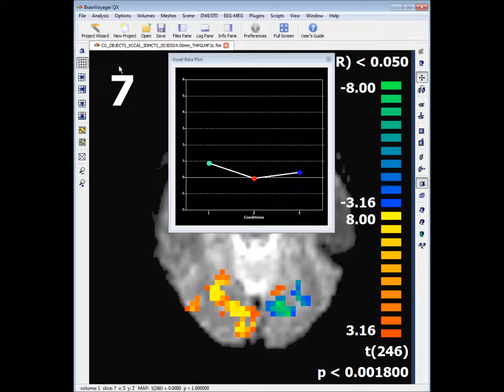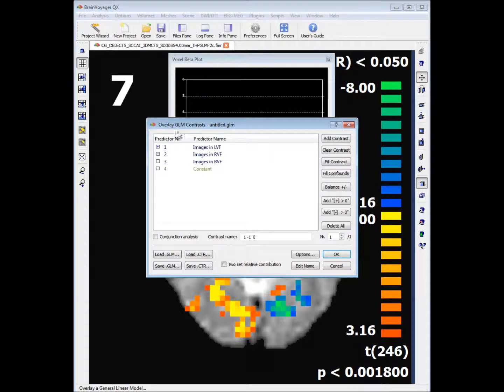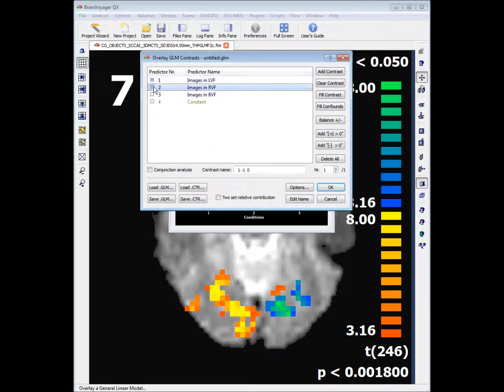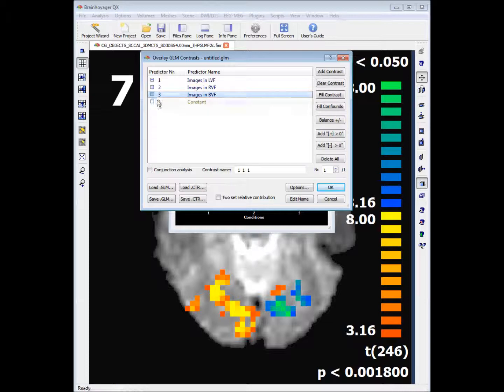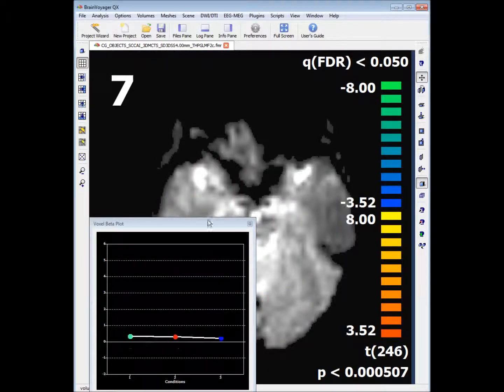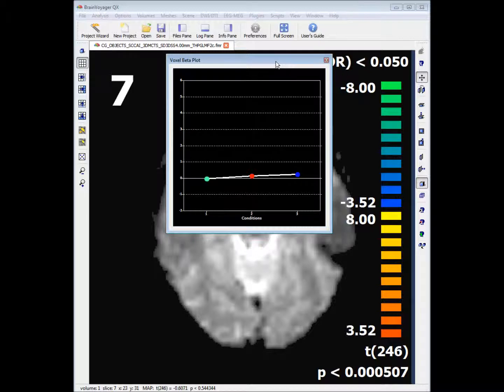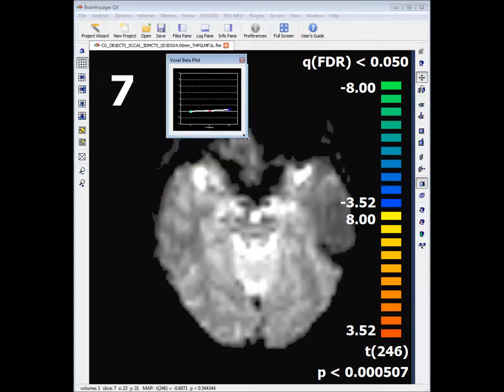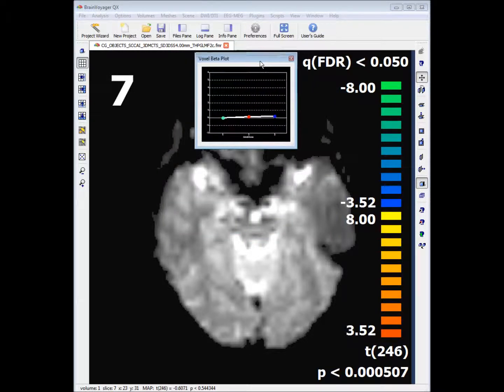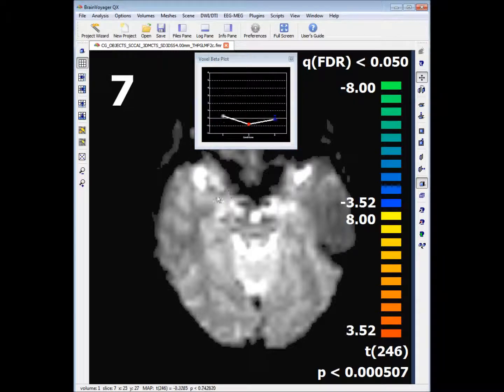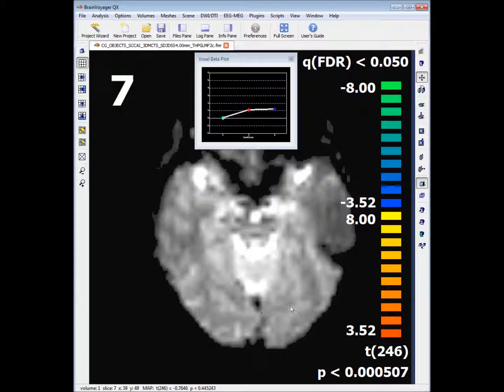If we were to have a plus sign for both Images in LVF and RVF, and a minus sign for Images in BVF, what we're seeing are regions where the activation for the first two predictors differs significantly from regions that are active for both visual fields. And intuitively that shouldn't differ at all. So if we click OK, what we would see is all of our regions of activation disappear.